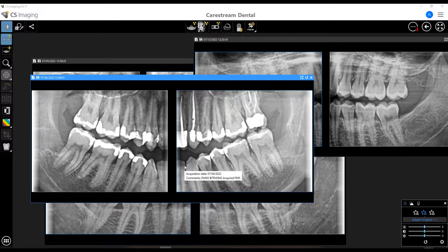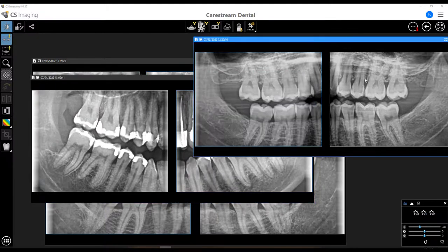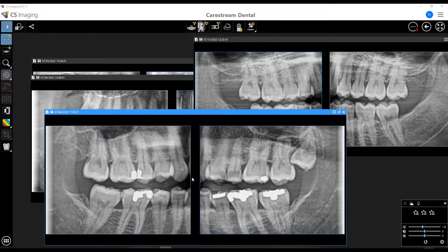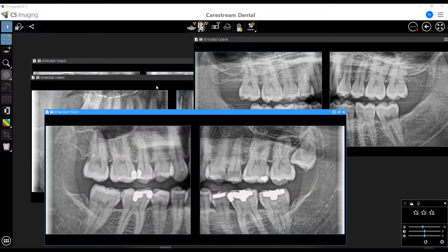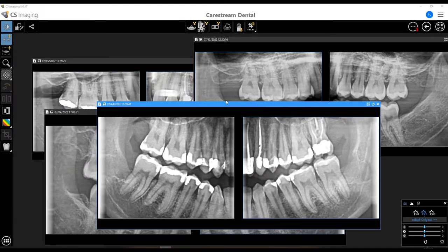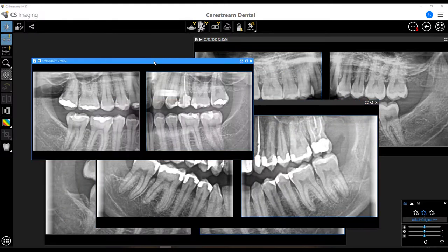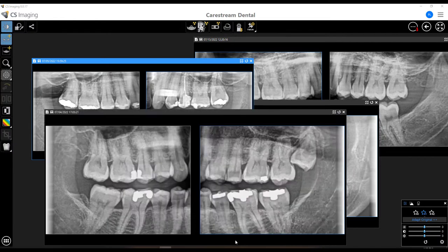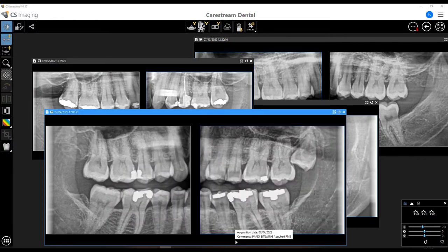You want the chin to be up where the occlusal plane is parallel to the floor, like you can see on these examples. On this one, the chin is just way too far down. The chin should be much higher than the positioning of a traditional panoramic image. I hope this helps.